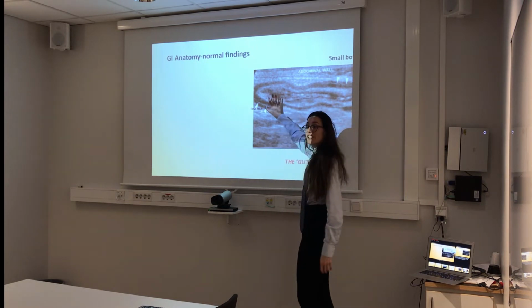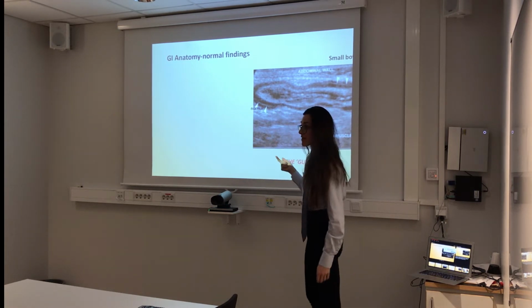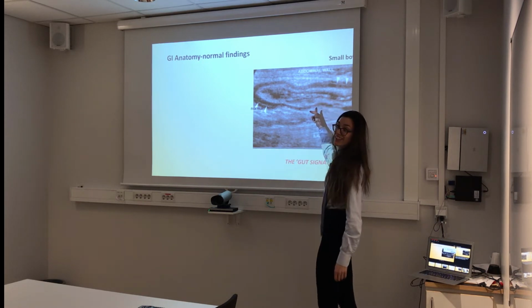Something that could be abnormal if we are talking about colon, okay? If the colon is looking like this, either this is a colitis, or there is a mass penetrating the walls of the colon. So this is the ranged view.